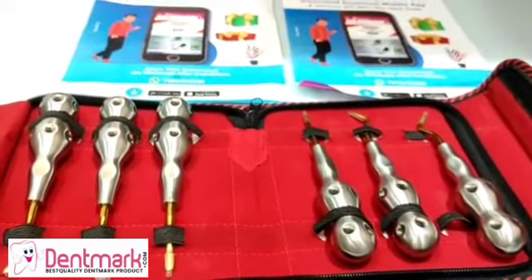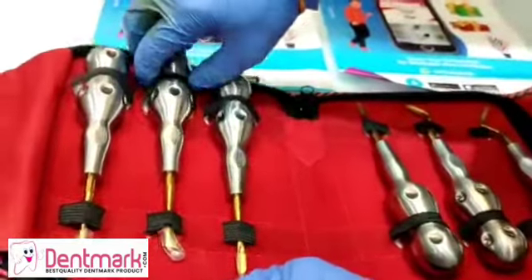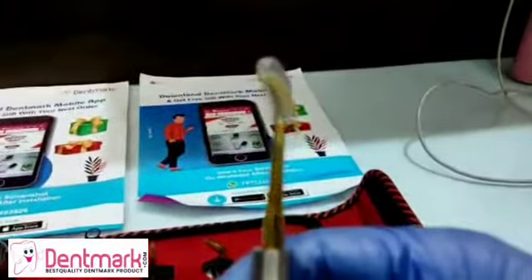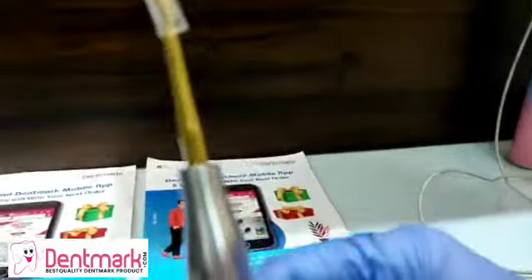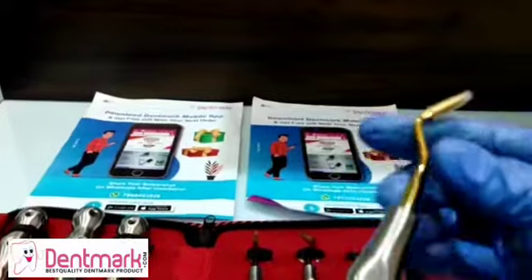The triangular elevators are used when a broken root remains in the tooth socket and the adjacent socket is empty. These are used specifically at those times when a broken tooth remains in the tooth socket and the neighboring socket is vacant.